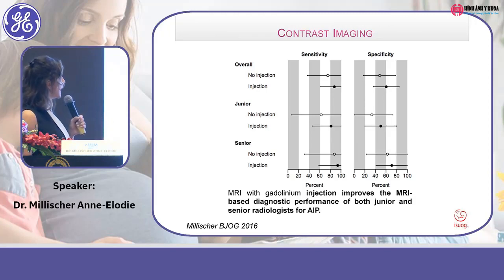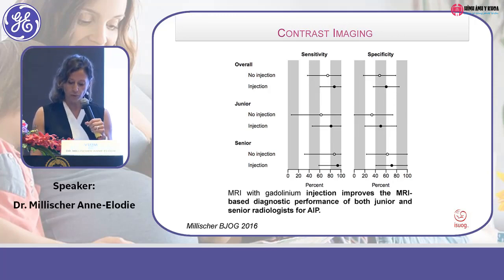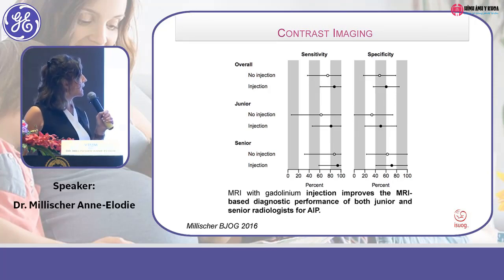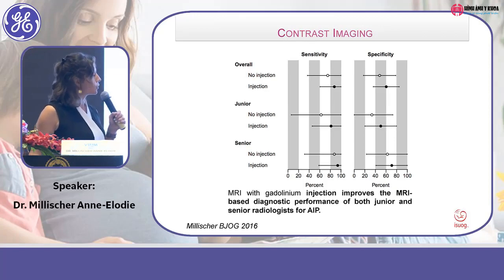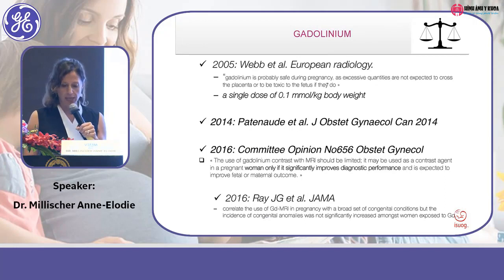pathology, the adding of contrast imaging helps them to do a more reliable diagnosis. And it improves also the capacity for the senior radiologist to diagnose placenta accreta with MRI.